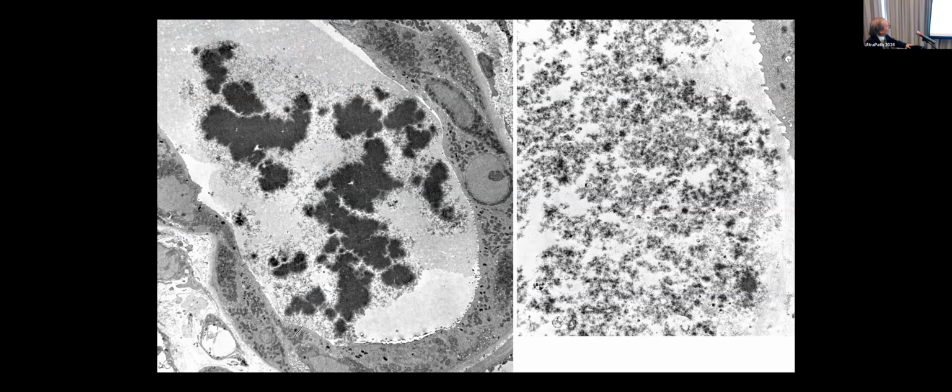There is isolated particulate material here, and sometimes it aggregates into a very dense geographic configuration that we see here, and there's a high magnification of the structure. So my conclusion is that there are situations in which the light chain deposition can appear as crystalline material, but it's still polyclonal, not monoclonal. The point that I think Dr. Guerrero will mention later.